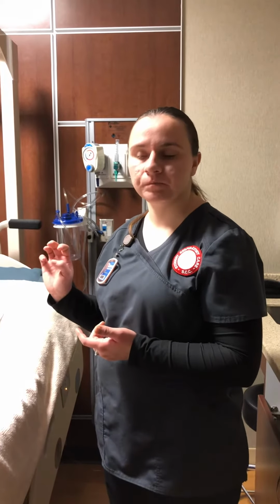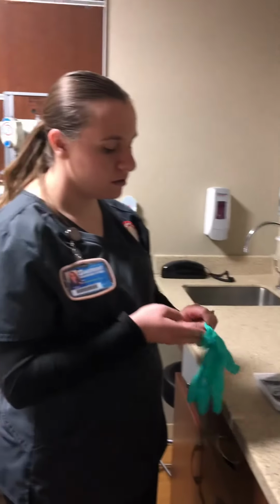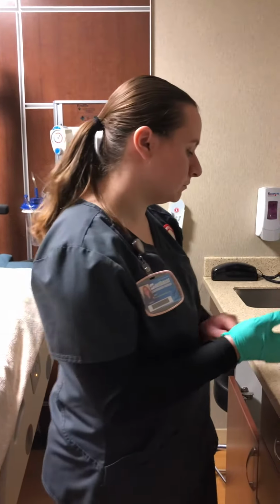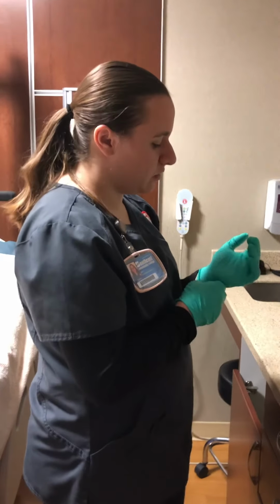So I'd always knock on the door, introduce myself, then I would check the patient's ID band, wash my hands, and I'd always assess the patient before I do a suctioning, like listening to the lung sounds and checking the vital signs. So I will get the patient ready. I'm going to apply all the appropriate PPE, and then I'm going to apply gloves, make sure I have appropriate gloves on. Everything's clean. I wash my hands again, and then I will get everything ready.